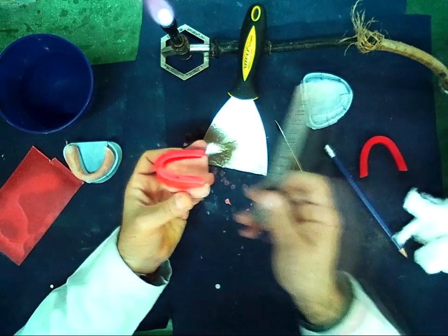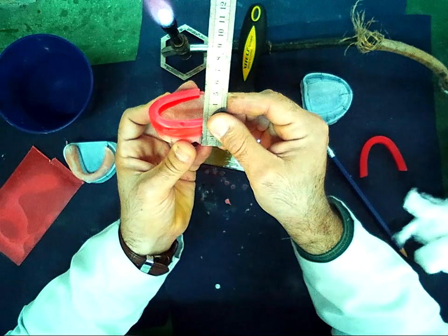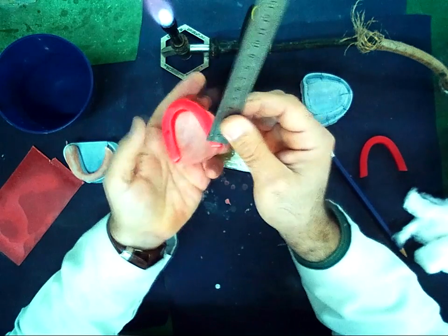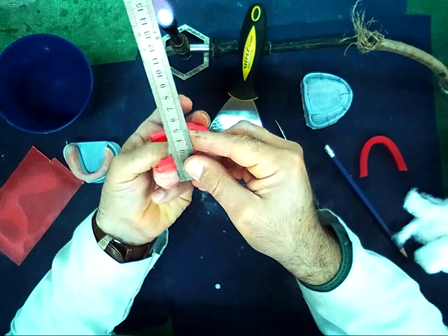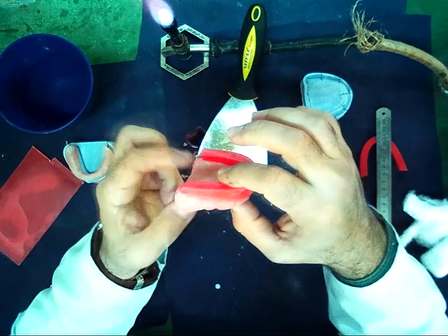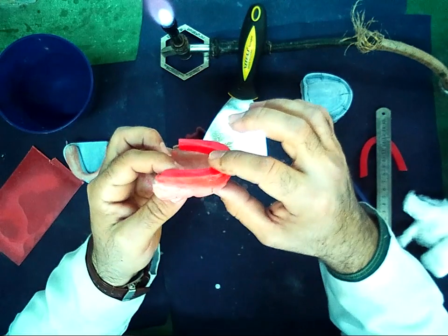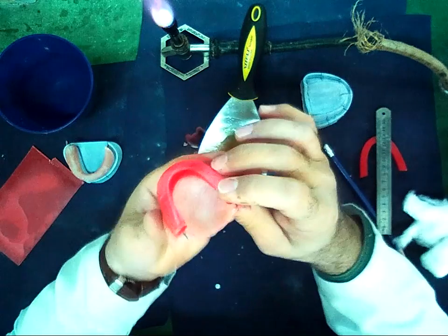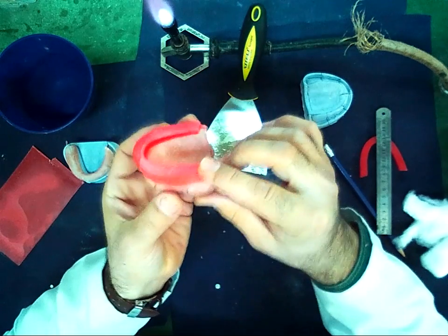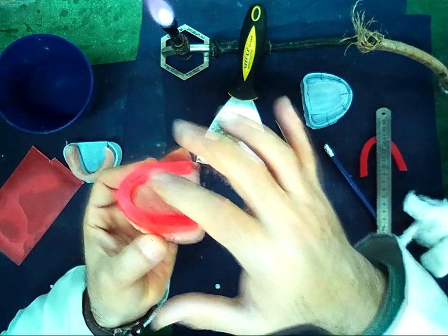Now I make my measurement again. It is 18, and in this side 18. The height of the bite rim now it's ready. The inclination should be from the 22 to 18.